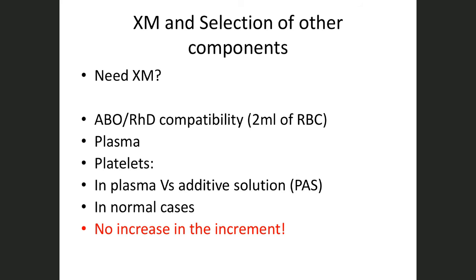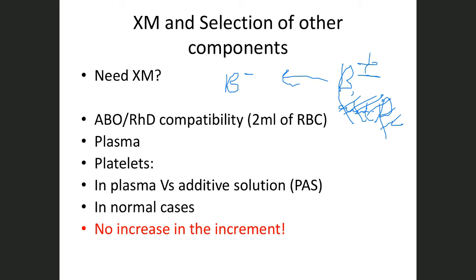Excellent. It's okay. Even if it's negative, I provide him with plasma from B positive. There are no, for example, anti-D. The serum doesn't have anything else, right? So we don't expect them to have anti-D. Even in general, we don't expect that this patient or donor has any antibodies. Okay, we don't expect them to have any antibodies.